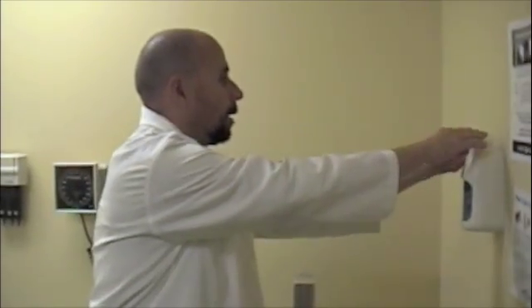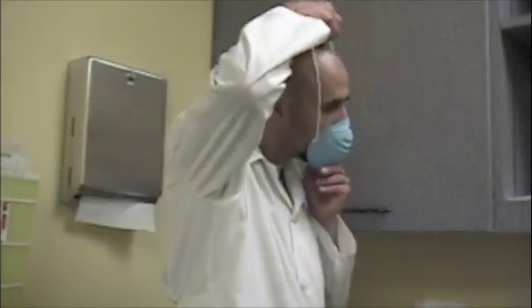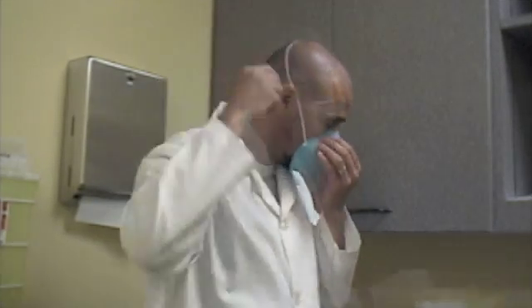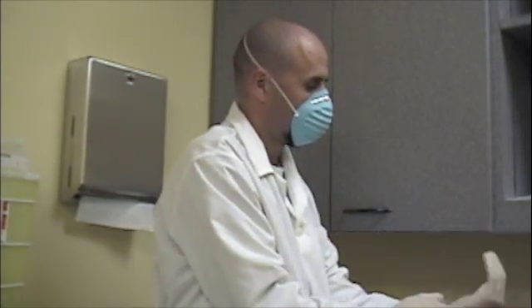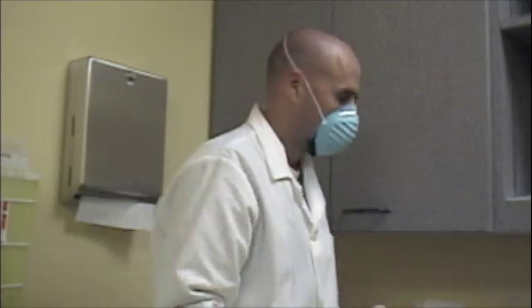Always wash your hands before starting, and wear gloves and a mask to protect yourself. Patients are virtually guaranteed to cough or sneeze during this procedure. Make sure you change your equipment between each patient as well.